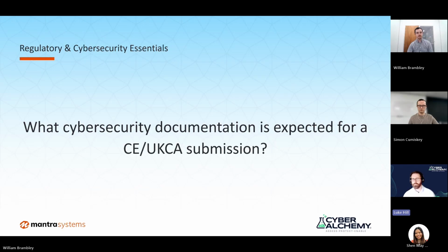Yeah, absolutely. So the notified body really want to see that you've considered cybersecurity across the device's life cycle, right? So everything from those early phases of development right through to the post-market stuff as well, which Simon was just discussing. Having good governance and cybersecurity risk management from there is always a really big plus. Also looking at threat modeling.